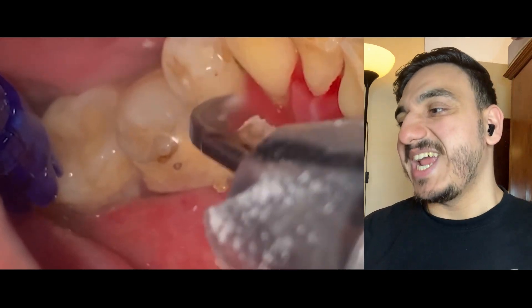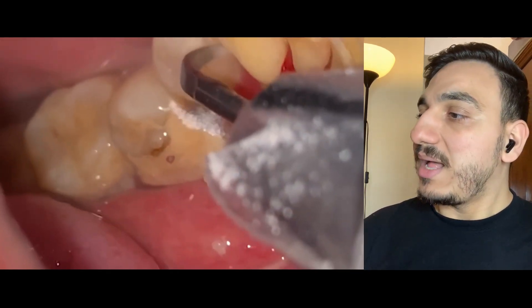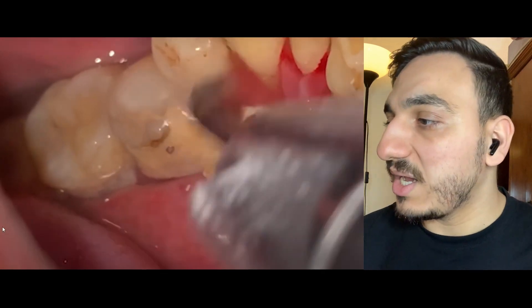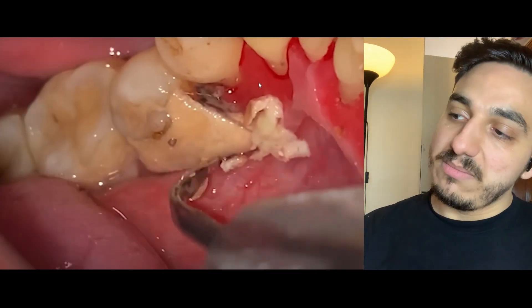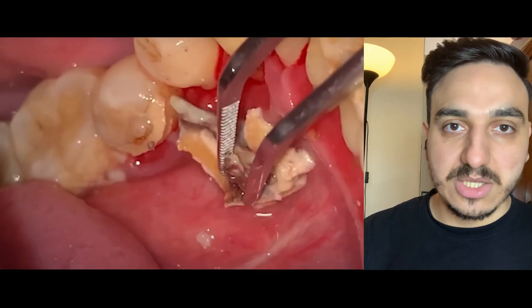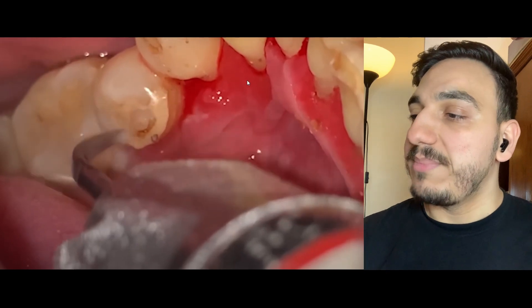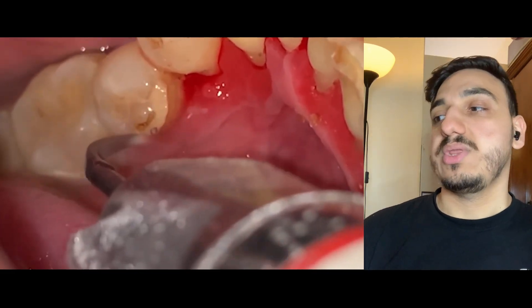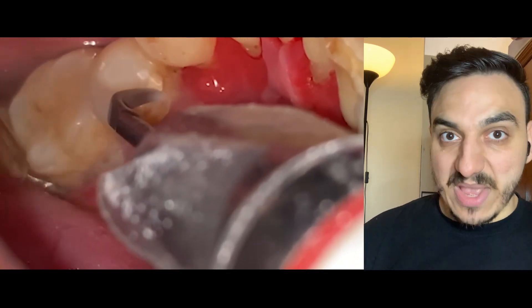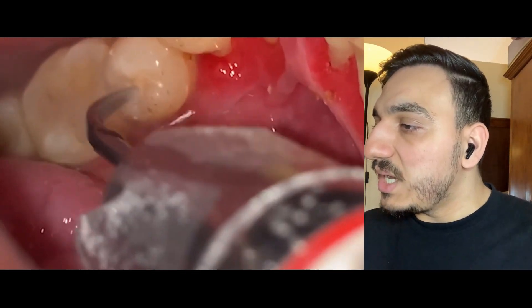The focus is on the lingual surface. I like that they're using a systematic approach — addressing the lower front teeth lingual portion. Look at the gum recession occurring here. Something really important: when gum recession occurs and the root is exposed, those areas are more sensitive. The root surface is covered by cementum — that's what that layer is called — while the most external layer of the crown is called the enamel, if you've ever heard of it.